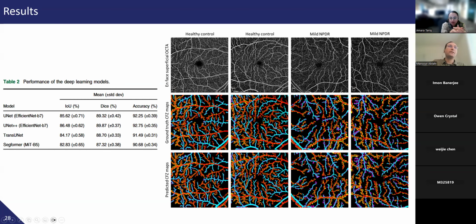local differences. But vision transformer models are very good at understanding the relationship between different regions of the image, because they are patching the image into different patches and have the self-attention module to understand the relationship between different areas of the image. They had a good performance, but compared to the CNNs, they couldn't outperform them because of this specific reason.